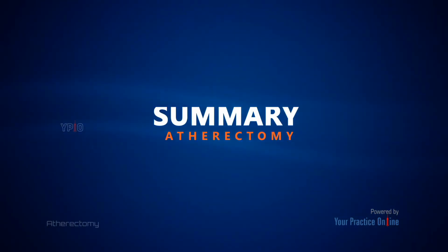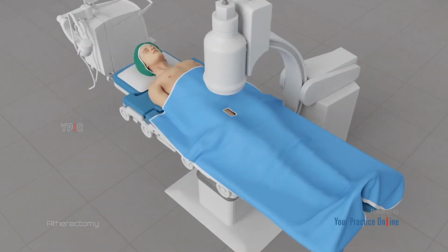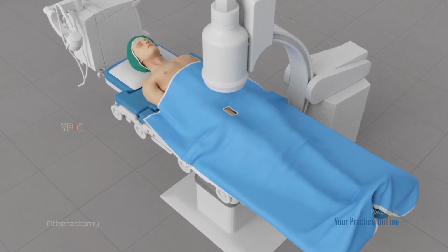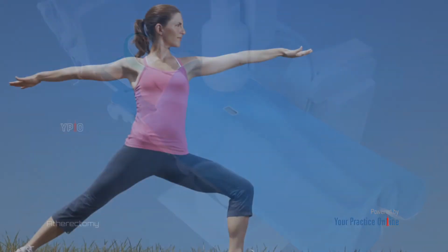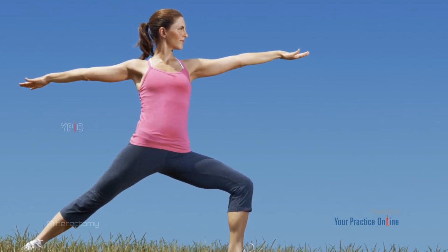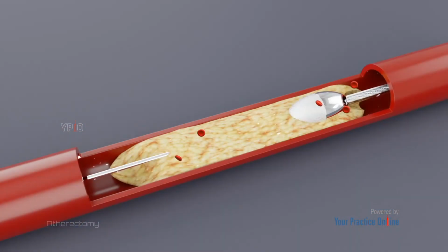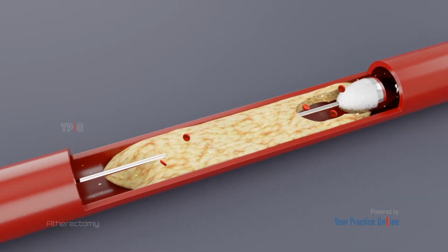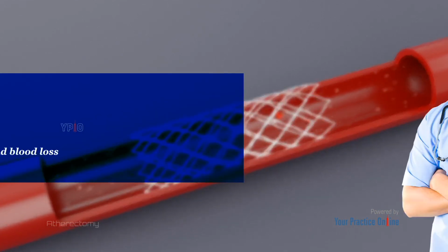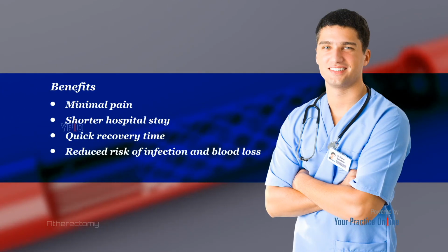Summary: Minimally invasive atherectomy surgery can provide significant relief from symptoms of atherosclerosis and its associated conditions. However, it is extremely important to follow a healthy lifestyle to ensure atherosclerosis does not recur. Atherectomy can be used as an alternative to angioplasty for the treatment of peripheral artery disease and coronary artery disease. The procedure carries several benefits, including minimal pain, a shorter hospital stay, quick recovery time, and reduced risk of infection and blood loss.